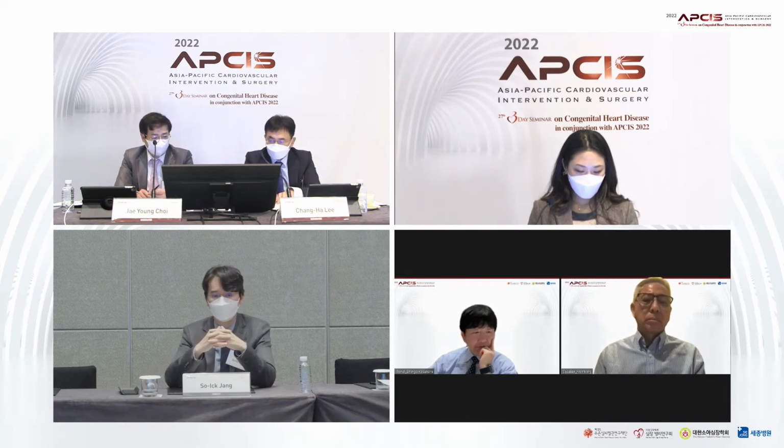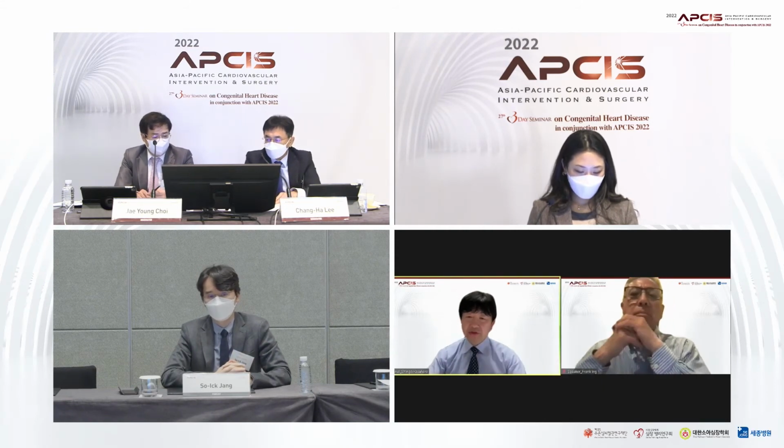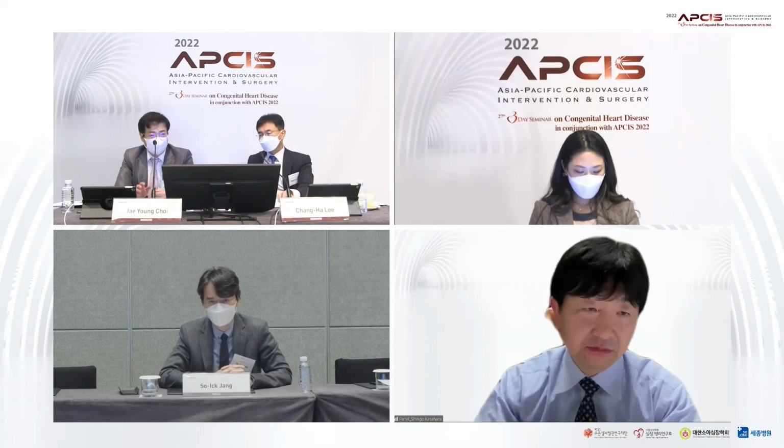Okay, Dr. Kasahara, would you add some comment? Yes, I agree with that, because proximal dilatation is needed. But with good proximal dilatation, competent pulmonary valves are very important, because with pulmonary regurgitation the pressure is very low. So I think good pulmonary artery development or growth needs competent pulmonary valves. So there are two options: a competent pulmonary valve or continuous flow. Yes, exactly.